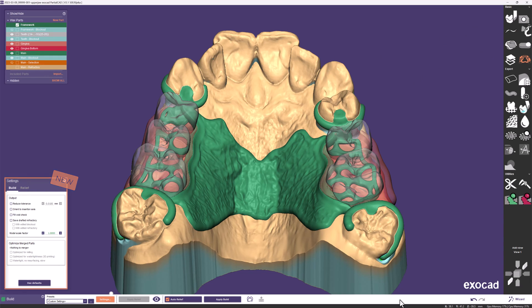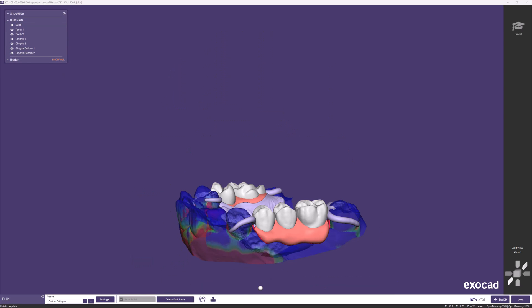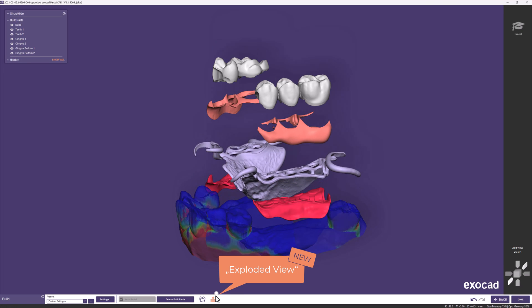Various settings in the Build step allow you to enhance your output even further, especially in expert mode. Once everything is calculated and finished, we're ready for production. There is one more feature to show: the Exploded View. Clicking this new button explodes your design, offering a unique view to see how all the parts fit together.